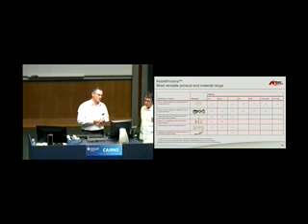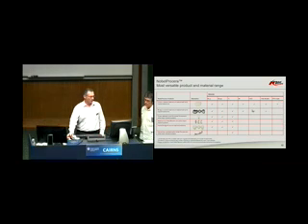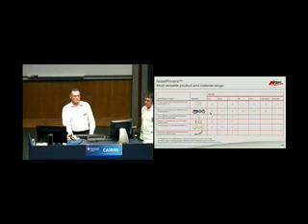As you can see, there's a variety of materials. Some are only single units, such as the Emax is only available in single units. Telio CAD, cobalt chrome, alumina, titanium, zirconia. For bridges, zirconia, coloured zirconia, titanium. For direct fixture, customised abutments.